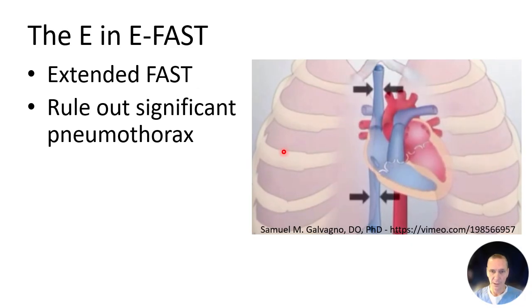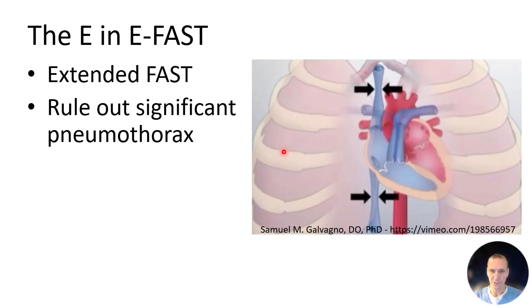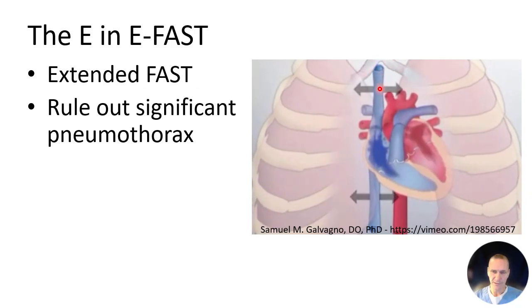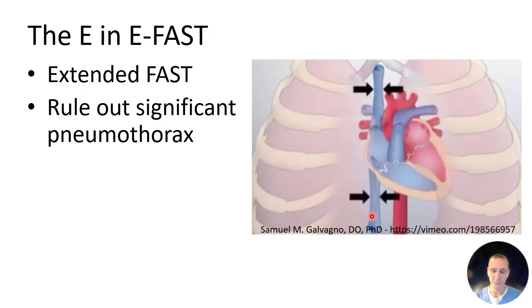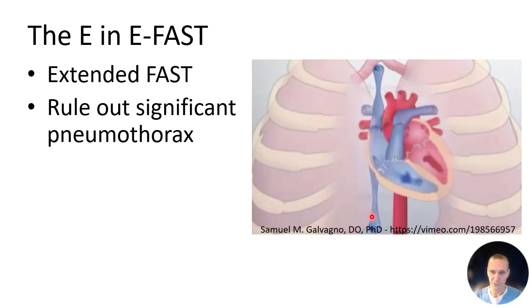Especially with tension pneumothorax, which I'll show images of in a second, this positive pressure reducing preload is even more dramatic on a patient who is volume depleted or in the setting of trauma who may be bleeding.